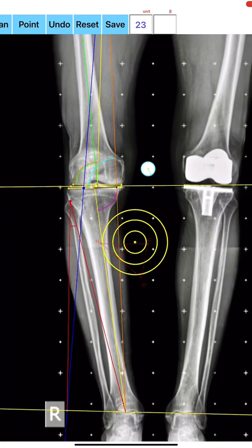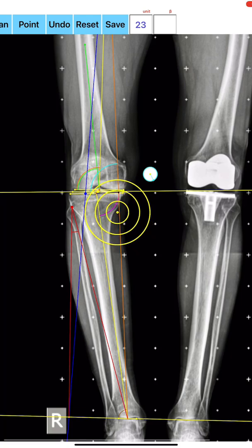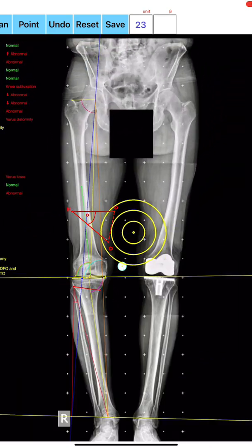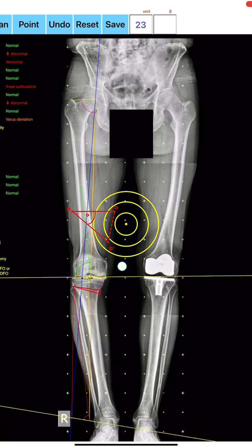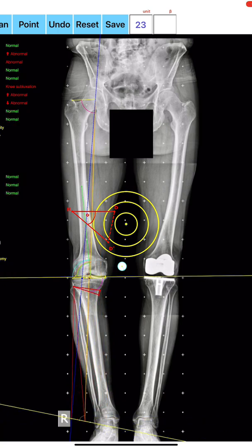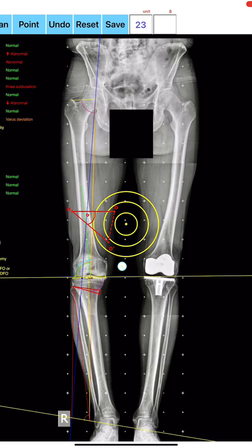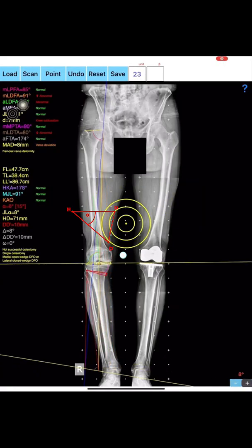By aiming at the preferred side across the H point over the other side of the bone with the circular centered pointer and pressing the point button, the surgeon selects the entry point D, starting the opening or closing wedge osteotomy. From point H to point D, the medial-lateral diameter of the opening or closing osteotomy is printed as HD in millimeters and marked by a red line, which represents one plane of the triangular wedge of the osteotomy.